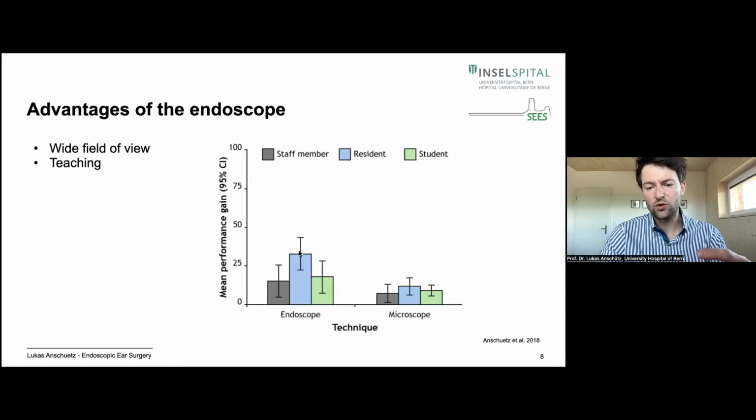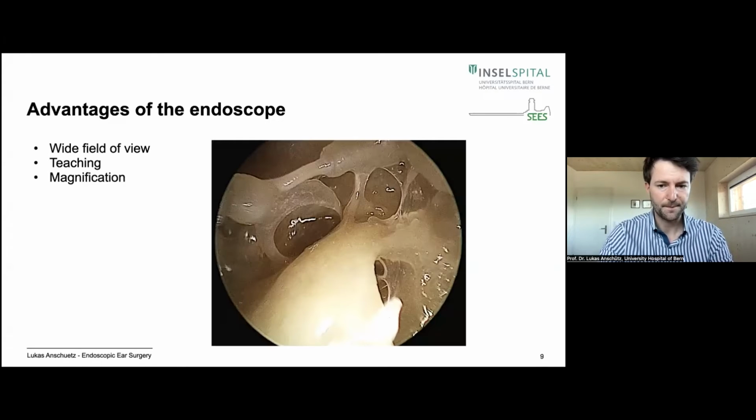I think those who already know some things can benefit a lot from the endoscope because they can actually see what you're talking about, and not only estimate that they might be able to understand what the topic of the talk is. And you can also see the staff members, they're trained otologists. You can see they also had a much greater gain of knowledge when they used the endoscope compared to the microscope.